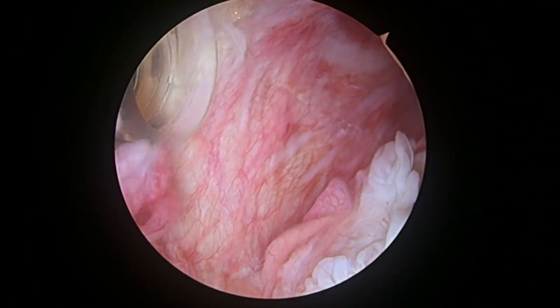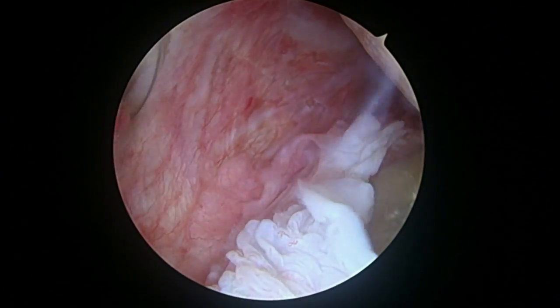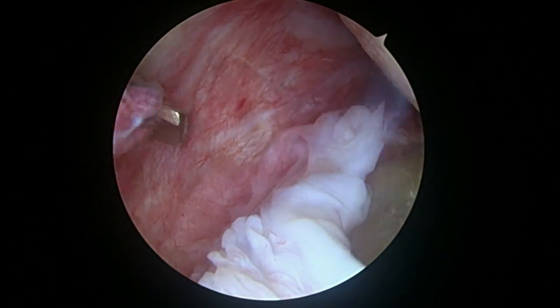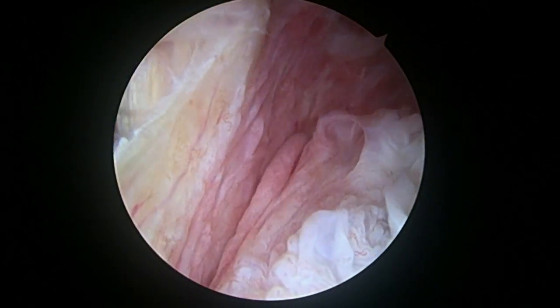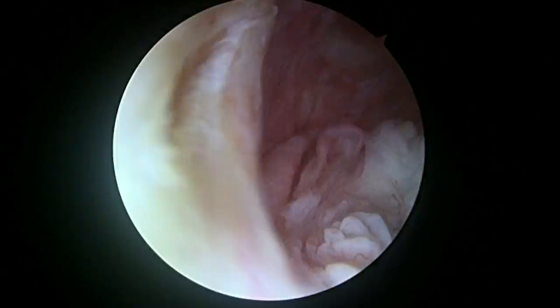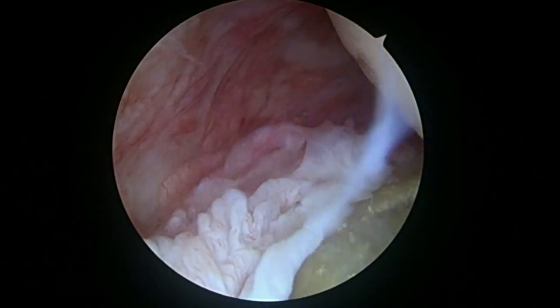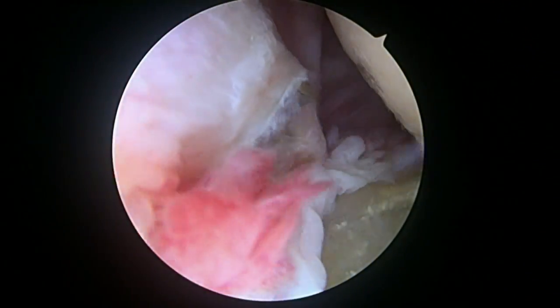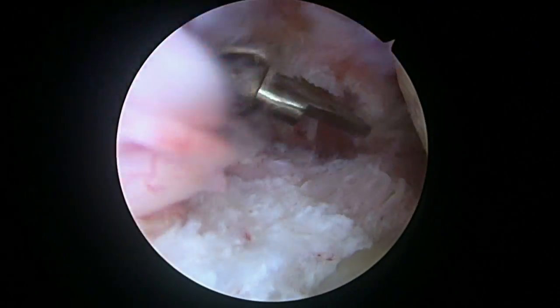I just need to make a little start here, and then it'll be easier. Here we are just releasing the rest of the capsule inferiorly.